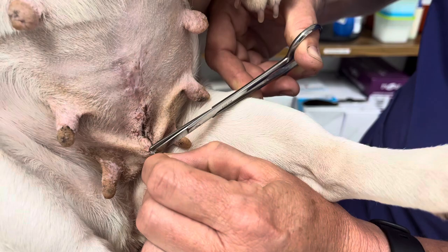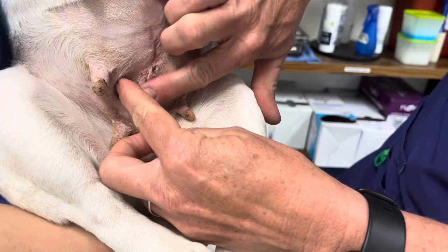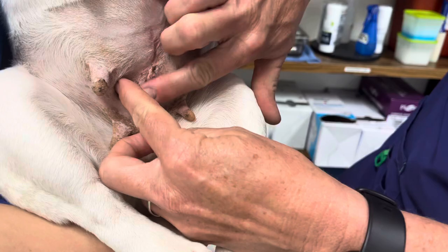And here is our last one. It has been exactly 14 days for Lola's procedure. She's got a little crud built up on her incision — that's fine, that's just some dirt and some skin sebum — but I like to pick that off with my finger and make sure the actual incision looks good, and it does. So Lola, you're free to have baths and run and play and do whatever you need to do.